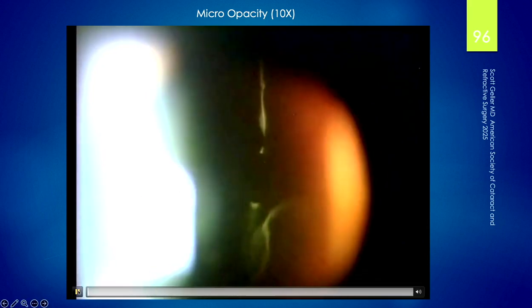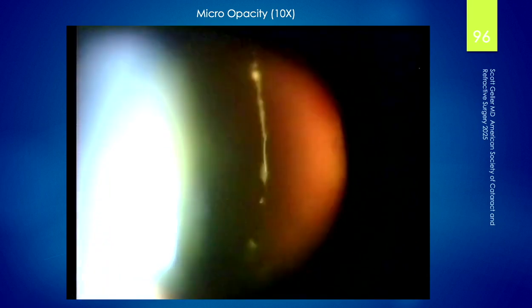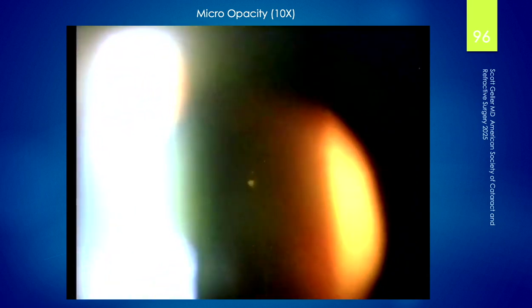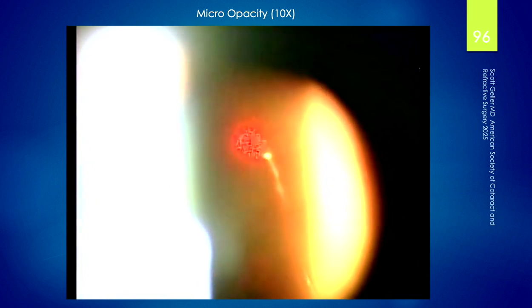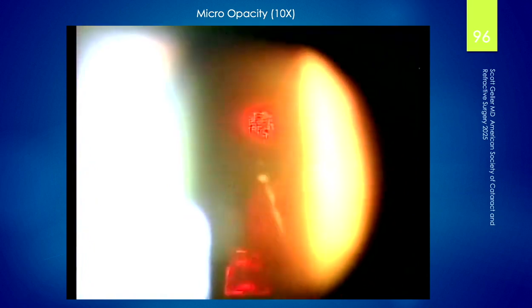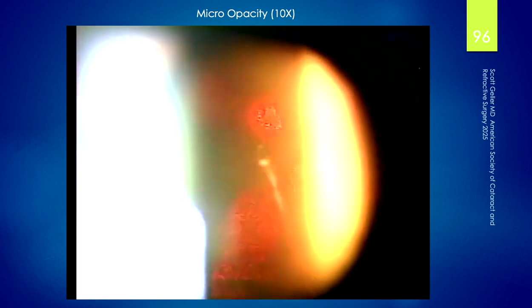Micro opacity. Sometimes opacities can be really small. They can be near the retina, and they're very disturbing to some patients. Who are we to judge? Let's see what we got here. Start that up. There we go. So that's very close to retina. This is a patient who was initially done elsewhere. It's speeded up. You can see by the aiming beam rotations.